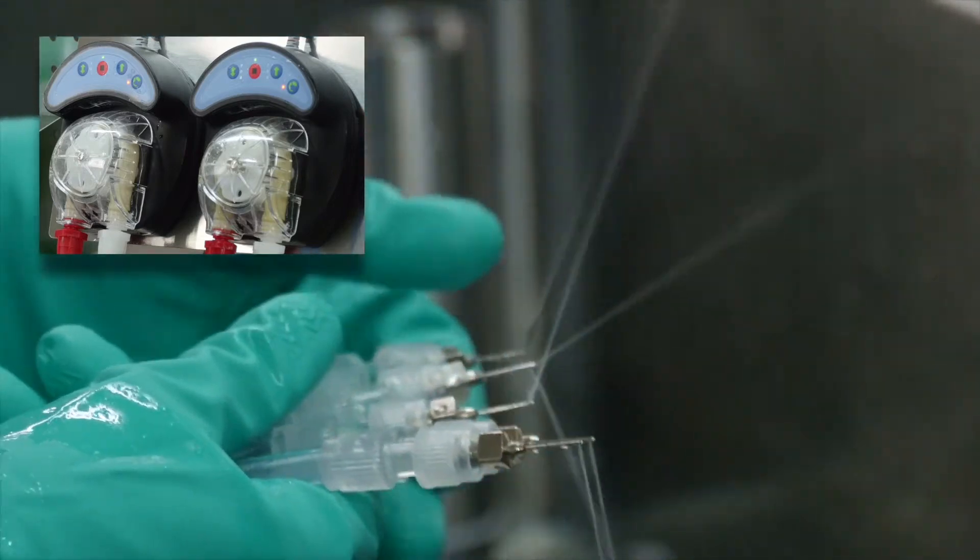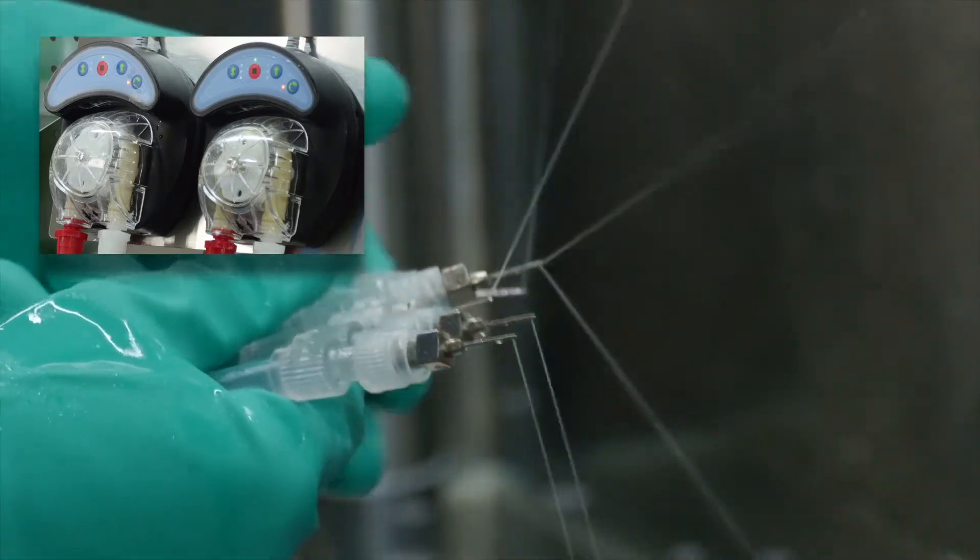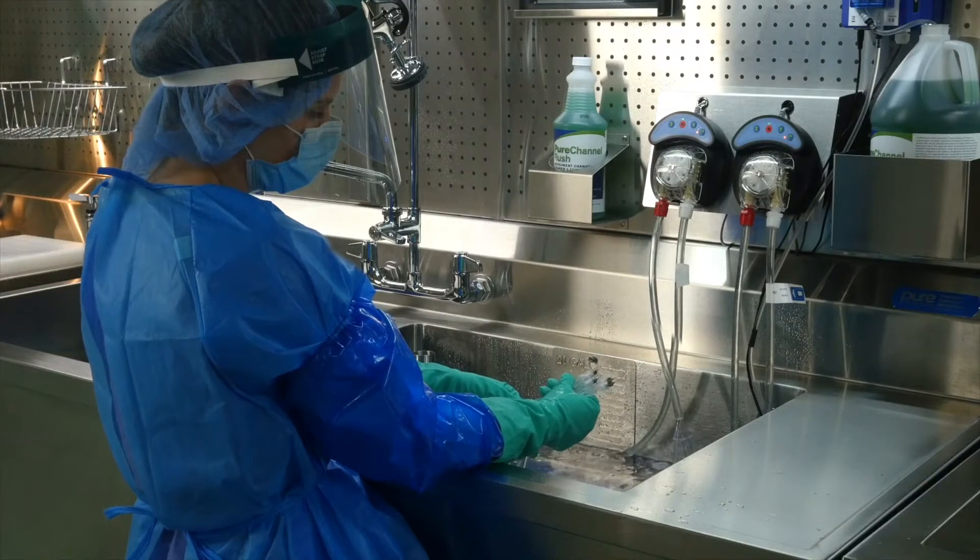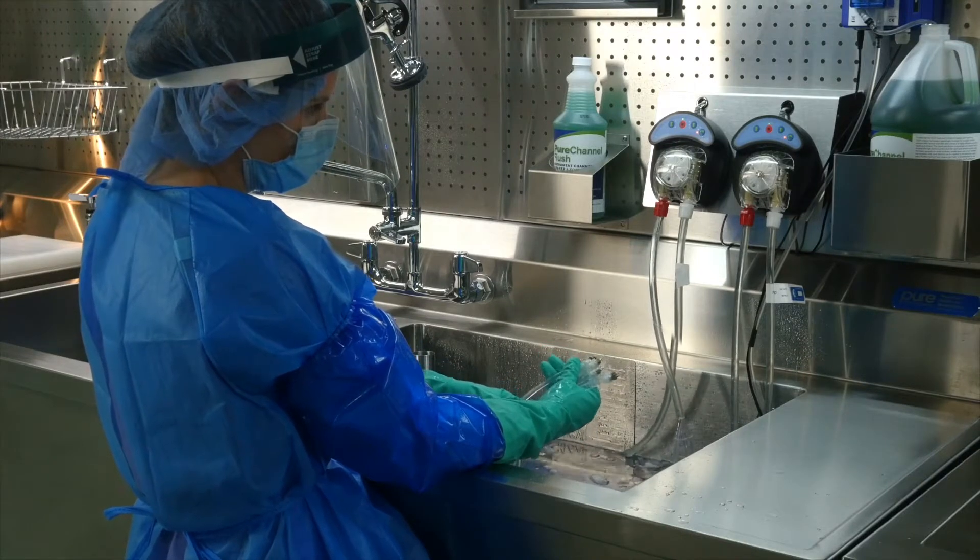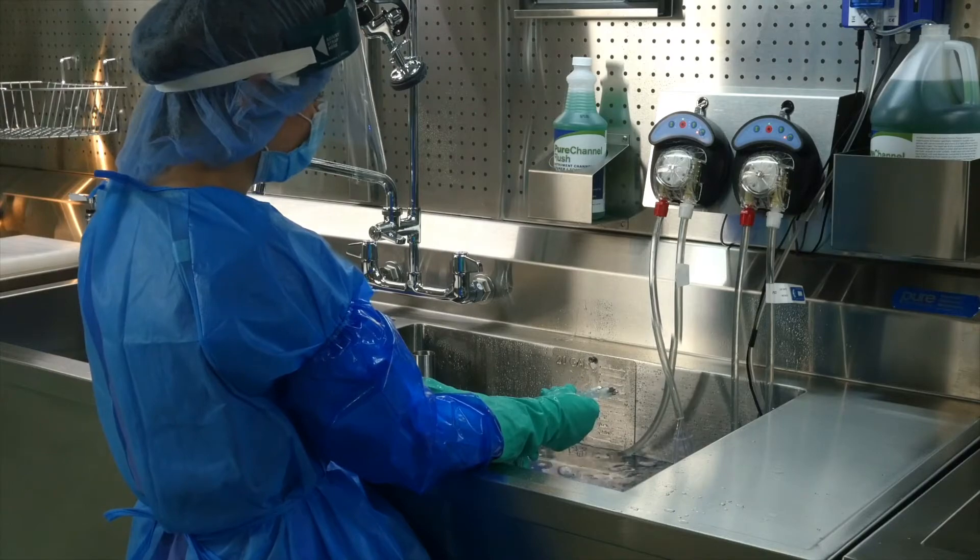The low speed setting provides around 500 milliliters of flushing per minute. 500 milliliters is the total volume and should be divided accordingly by the number of instruments attached.